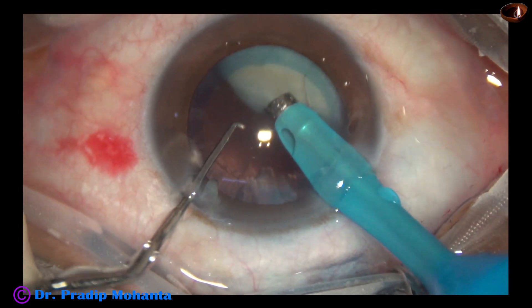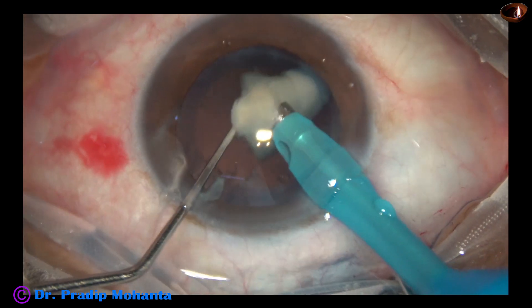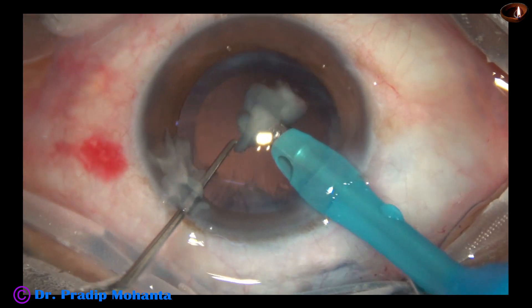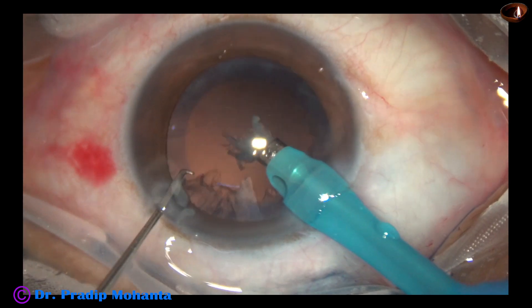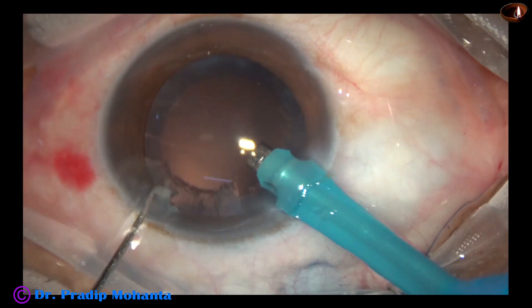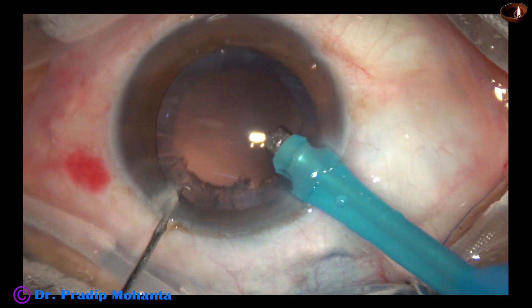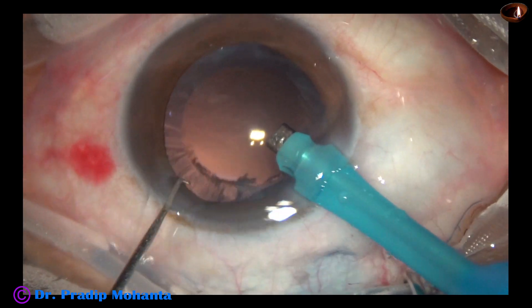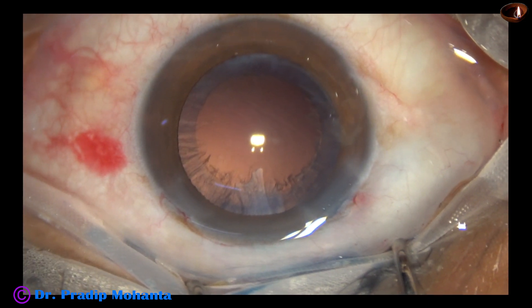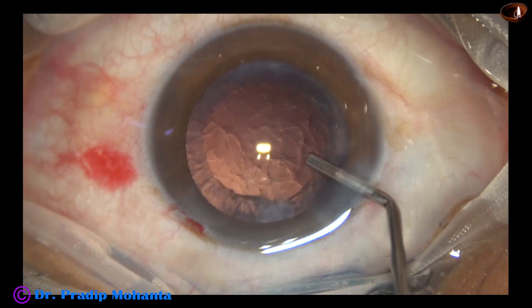During emulsification of the last piece, the vacuum is reduced further to about 300 millimeters of mercury and flow rate to about 30. All the small nuclear bits have come out through the side port, and now a lot of cortex is there in this case.